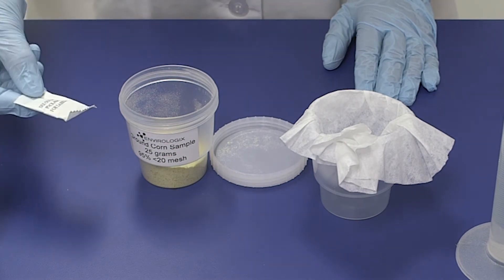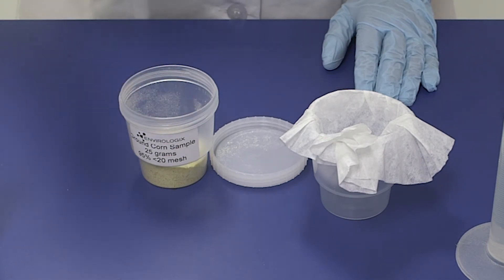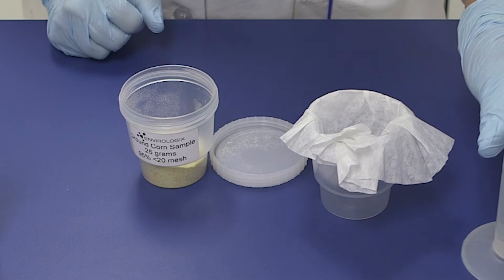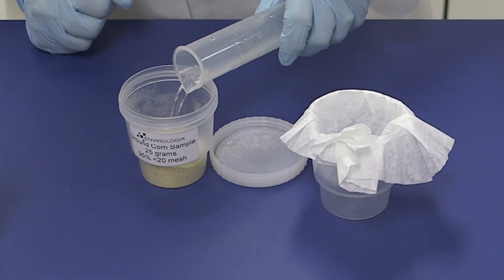Add one EB-17 pouch to the cup. Add 75 milliliters of deionized, bottled, or distilled water to the container.